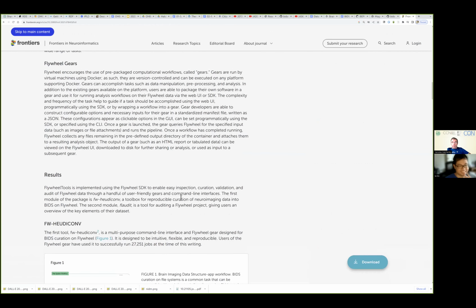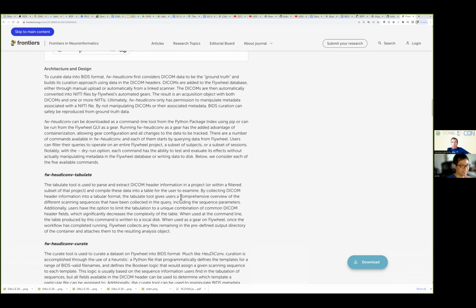Yeah, this is actually new to me. I will definitely check. Okay, so we are looking at diffusion weighted imaging, trying to understand where to put all kinds of useful stuff. CBF, is that what we have here? CBF? No, some tensor, ADC. There's a tensor there. But that's probably different. These all look like derived information, right? And for that, I bet there is BIDS.